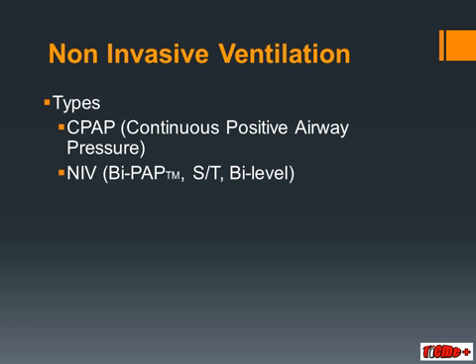Okay, so let's start just by clearing up some of the nomenclature. In the literature, non-invasive ventilation is separated from CPAP. In general clinical practice, we tend to call either CPAP or bi-level non-invasive ventilation. So CPAP stands for continuous positive airway pressure, and essentially just delivers a continuous single pressure.